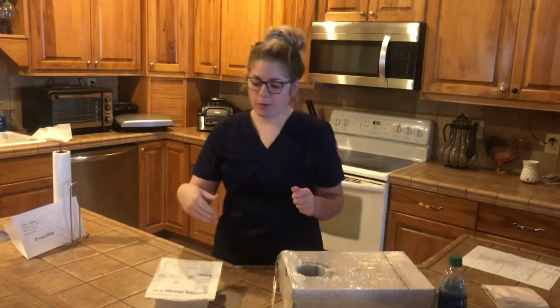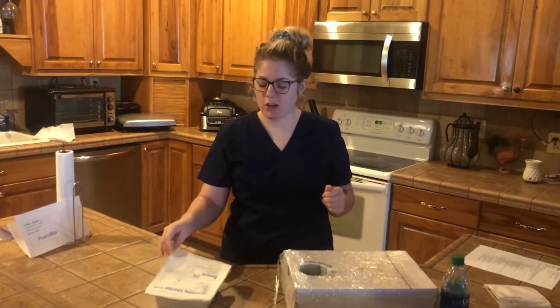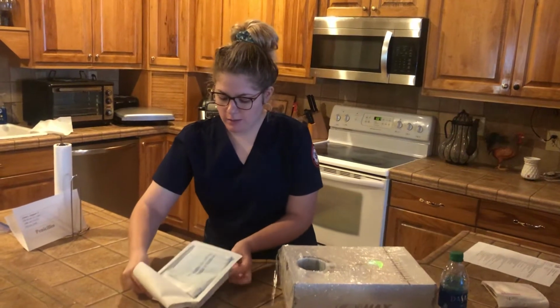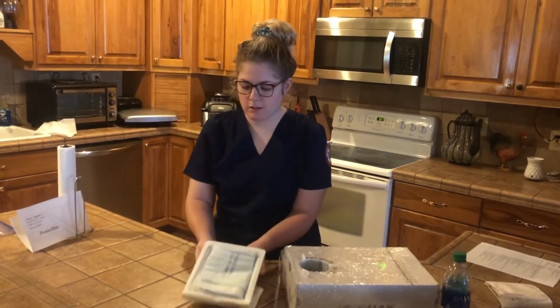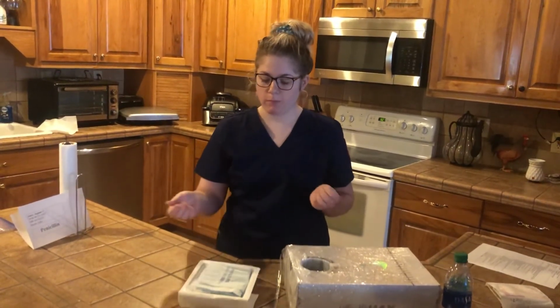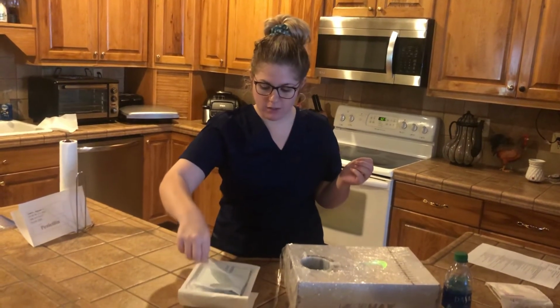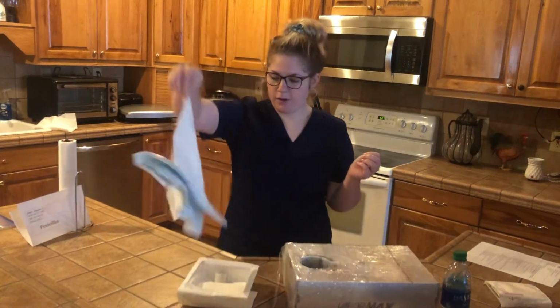I now will open up my dressing tray, being careful not to touch the top of it, and remove my sterile field, being careful of the unsterile 1-inch border.